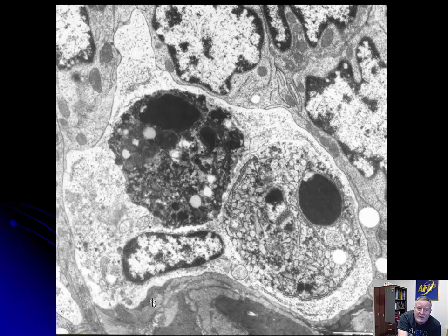And just a better picture of macrophages, which are digesting apoptotic bodies of cells in a prostate carcinoma from a rat. Okay, here is your macrophage. And the macrophage, here's the nucleus. Macrophage has ingested 2 fragments of the degenerating prostatic epithelium. This one still looks pretty good. This one has a big crescent. You can only see a little bit of the residual euchromatin, but there's a nice nuclear membrane here.